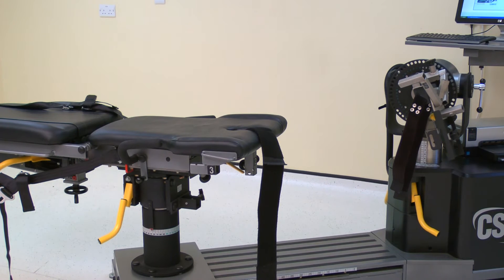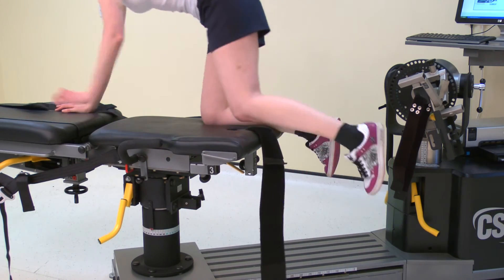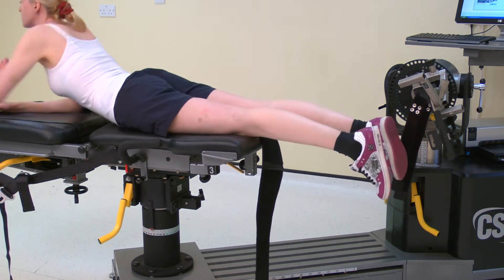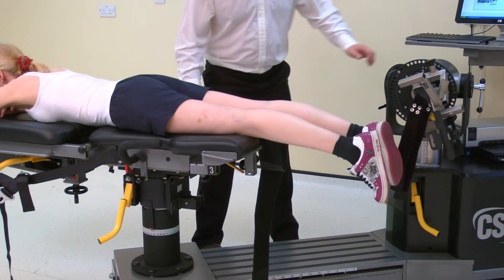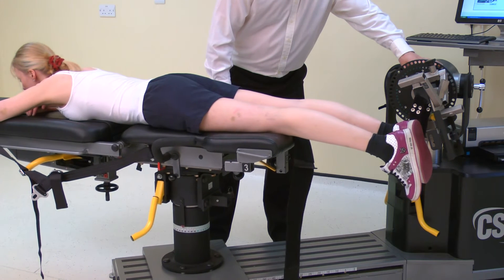Once the machine is positioned, ask the subject to lay prone on the chair. Adjust the monorail and dynamometer height so the foot will contact the foot plate.